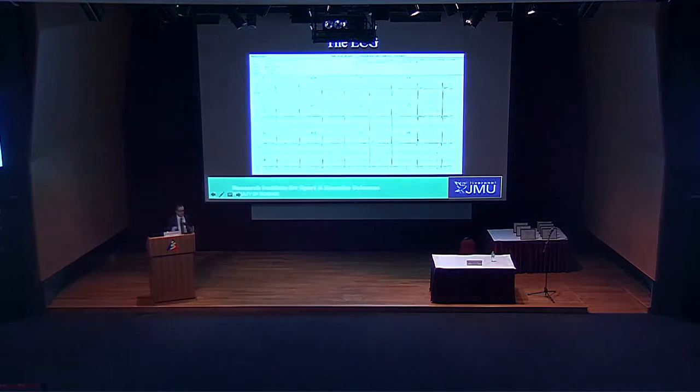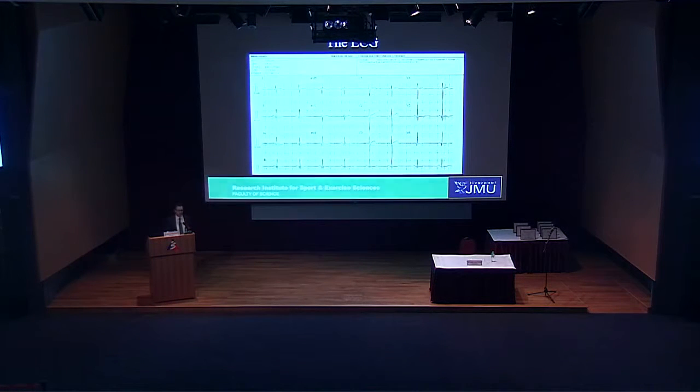ECG, conscious of time, but hands up, normal. Hands up if you think this is a normal ECG. Okay. Abnormal. One thing that jumped out at us when we did this was very subtle T-wave inversion here, and some flattening of the ST segment that you could say is going down to about 1 millimeter here.